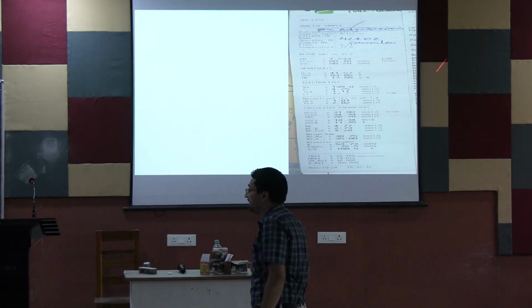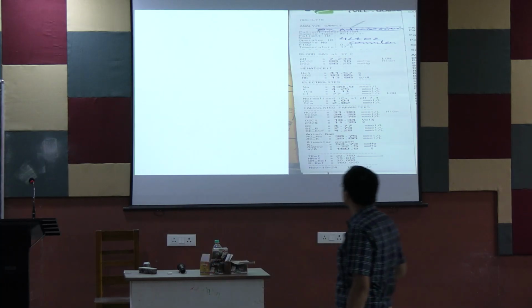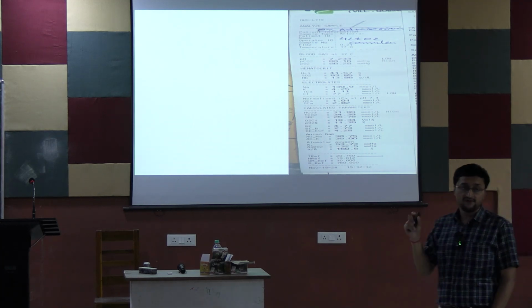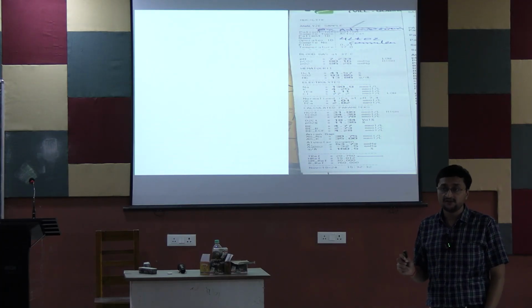Now this is the ABG chart, right? দেখ কি বলেছিলাম, basically first the identification, patient number or patient name will be there, patient ID, anything, operator name, and this is very important, temperature is mentioned, right? 37 degree. FiO2, this is also important. In every ABG estimation chart, FiO2, that is fraction of inspired oxygen, will be mentioned. Why this is important?